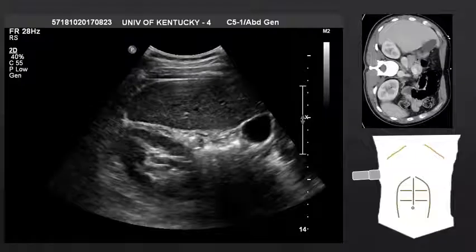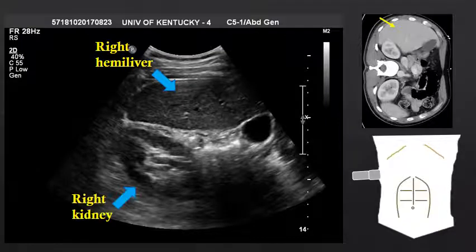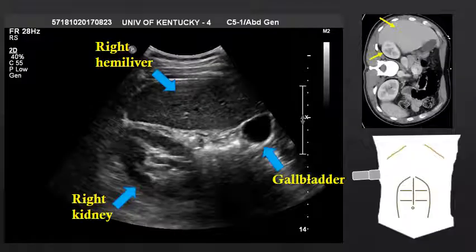If we now move into a transverse view, oriented on the right lateral subcostal region, we see the kidney come into view. The right kidney sits just alongside the right hemiliver, and we can also see the gallbladder within our view.